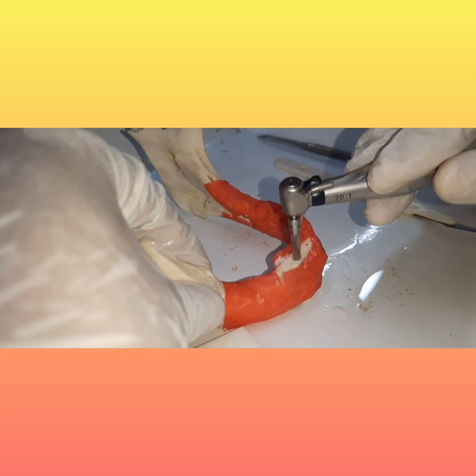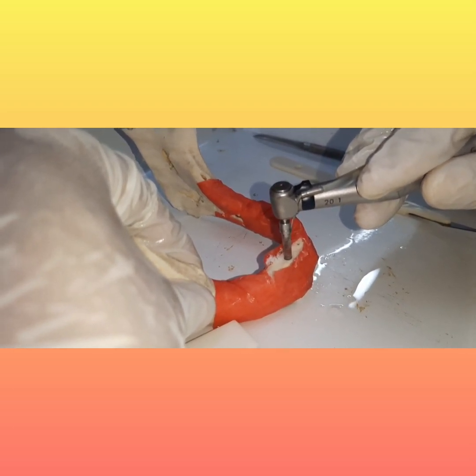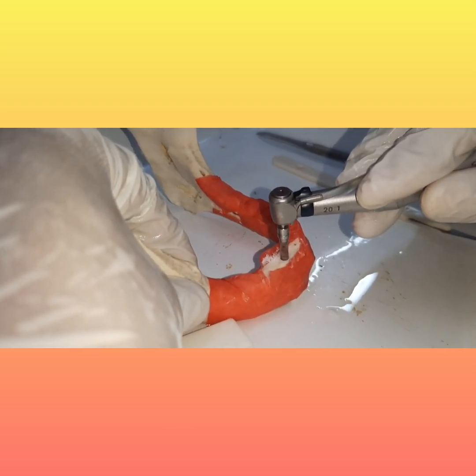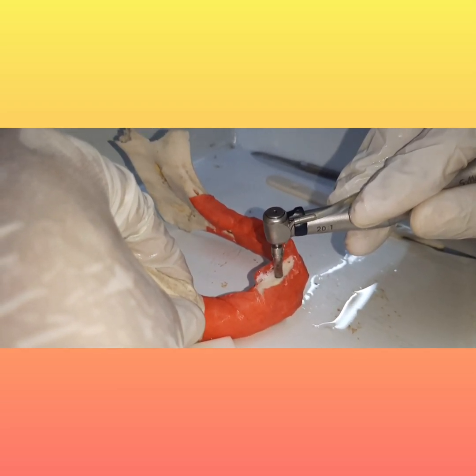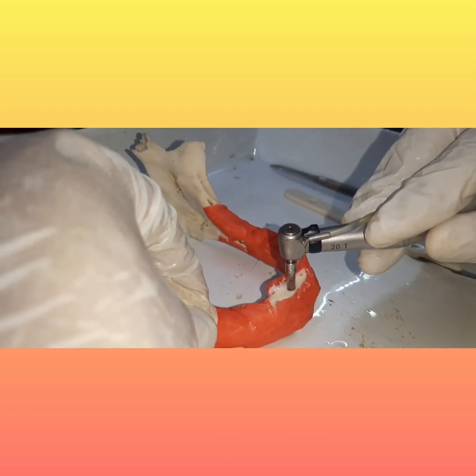Very smoothly you go. Feel the bone always and never apply pressure. Control. That's it.